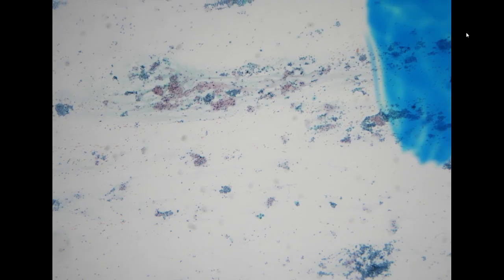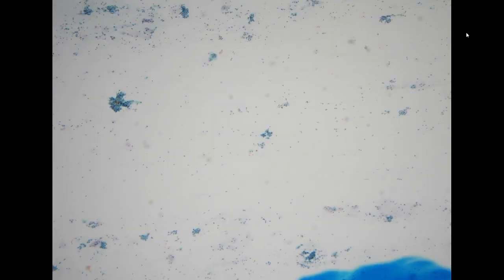So when you see something like this, you just check the history. Without any surprise, the patient had a prior history of primary lung adenocarcinoma. So this is compatible with metastatic lung adenocarcinoma.